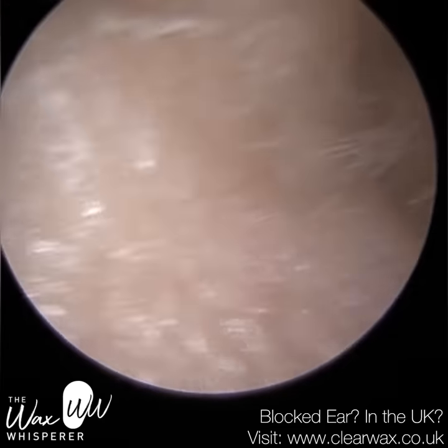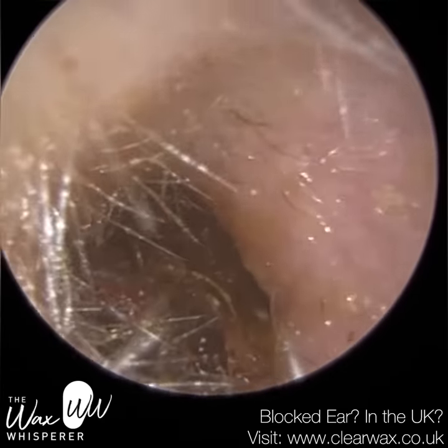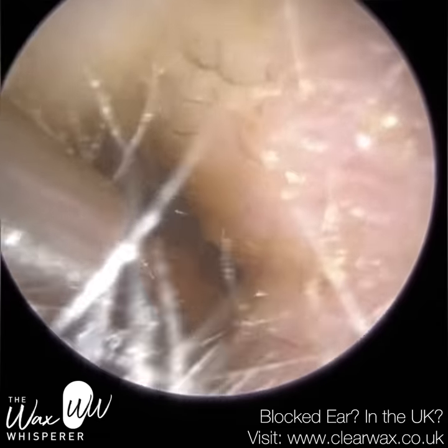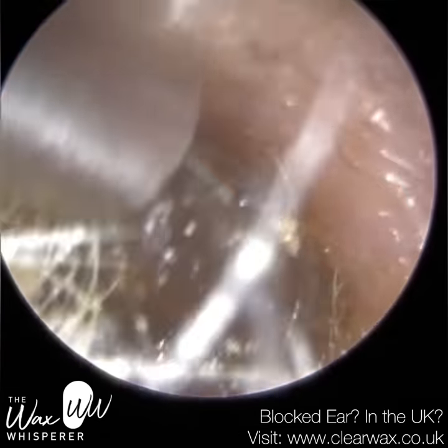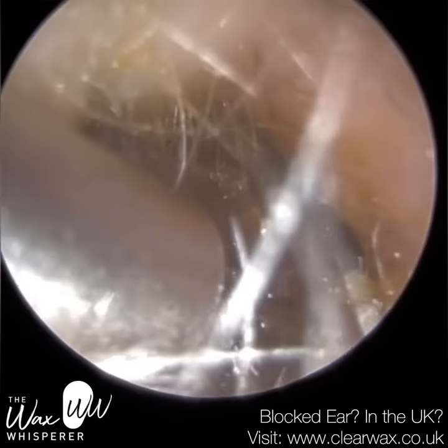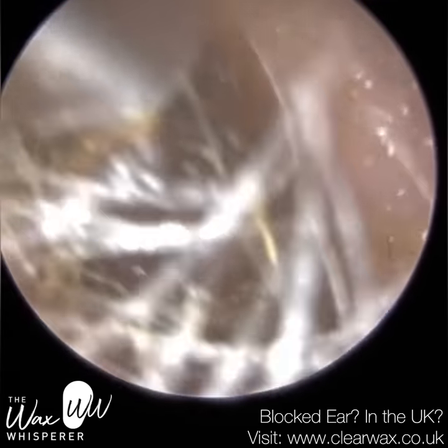So there is quite damp — it's a bit wet in there. Because they've used a lot of drops, the wax is a bit sticky, but slowly but surely we're bringing this through. You can see the suction probe only just really fits into the ear. The ear almost looks like a paediatric ear, so a child's ear, but this patient is significantly older.